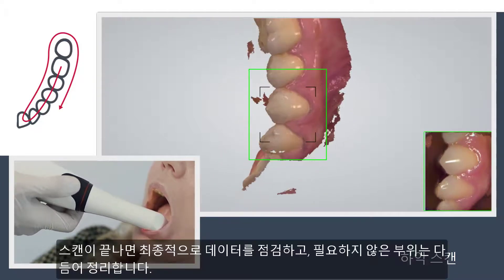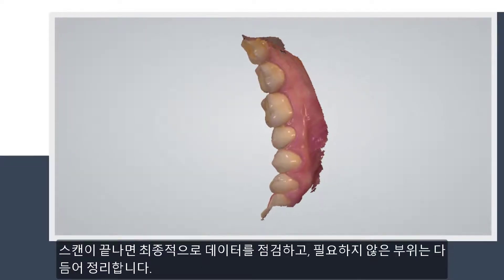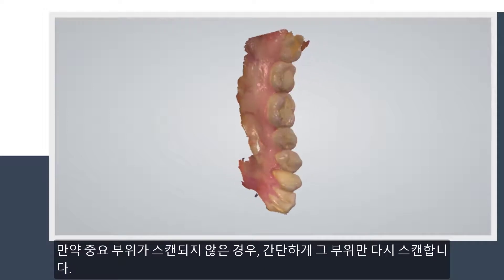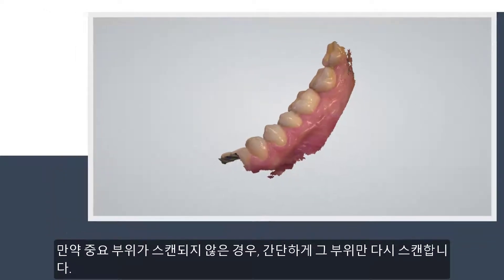When the scanning is complete, you can inspect the result and prepare the scan by trimming unnecessary parts. If an important area is missing, simply start scanning that area.